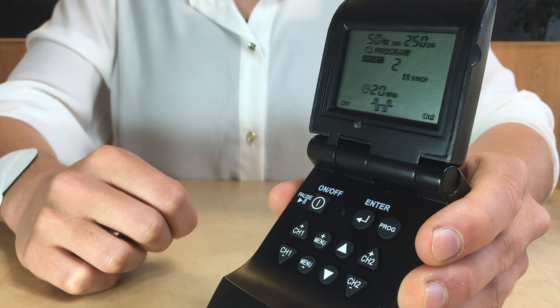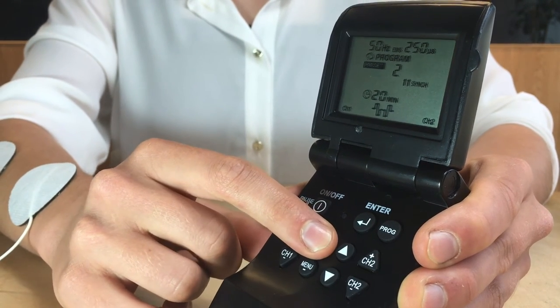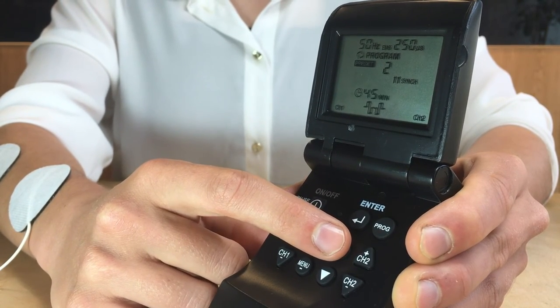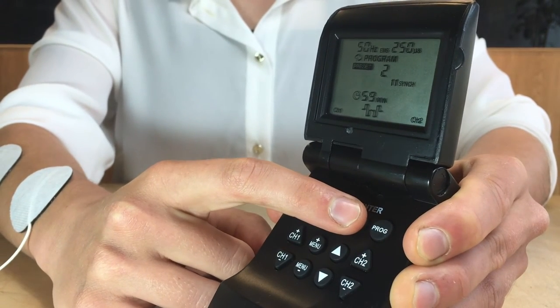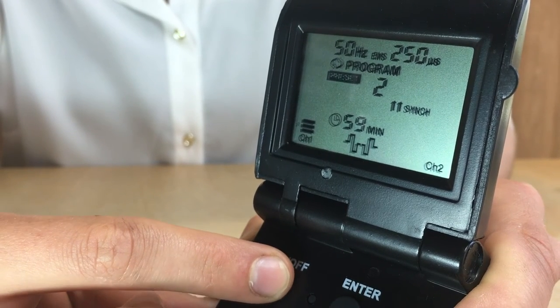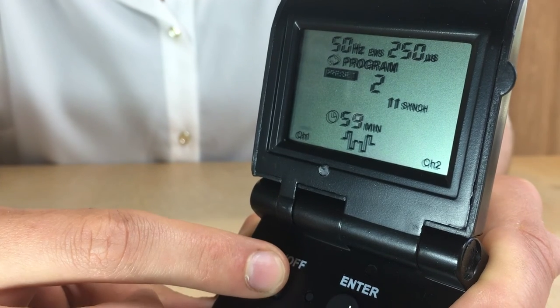A timer can be set to run through a treatment at these settings on any of the programs, preset or manual, by pressing the plus menu button and the up or down arrows to set up to a 90-minute period. Press Enter to store the timer setting. At any time if you want to pause the treatment, simply press the On-Off button briefly — this will pause the session. Pressing the On-Off button briefly again will restart the session where you left it.